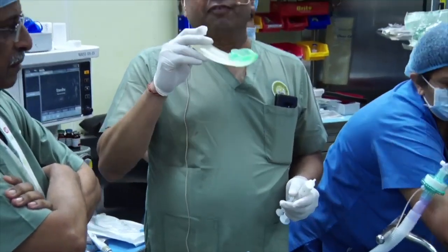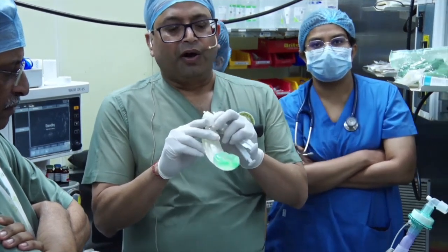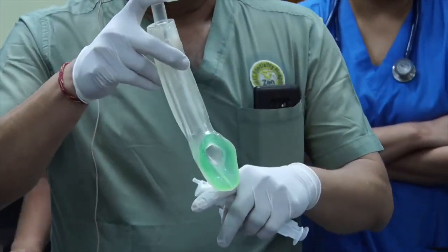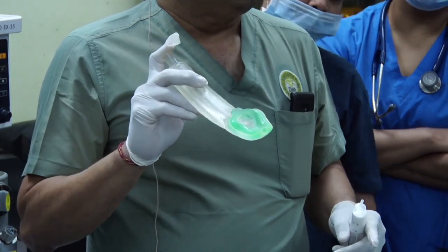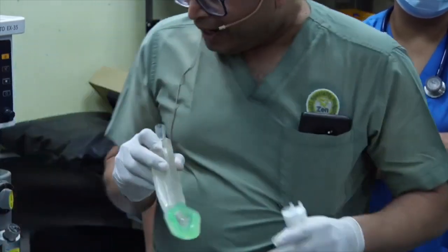You need to hold the i-gel near where you attach your circuit — not in the middle, not near the tip. The reason is that as the i-gel goes in and you apply pressure, it will likely bend and click in. That is the biggest mistake I've seen people make.